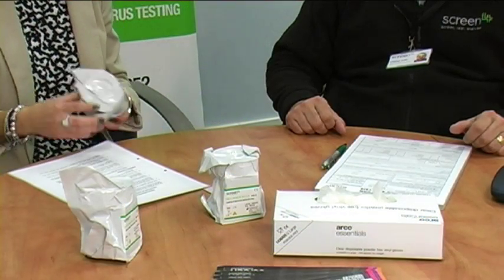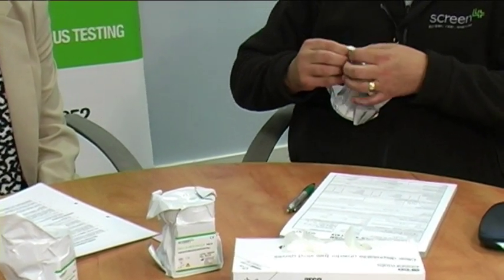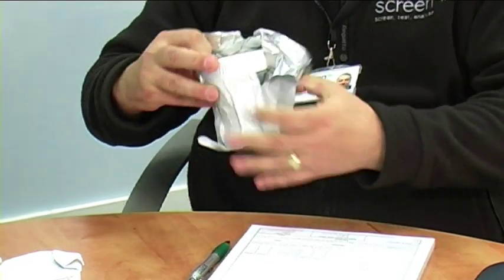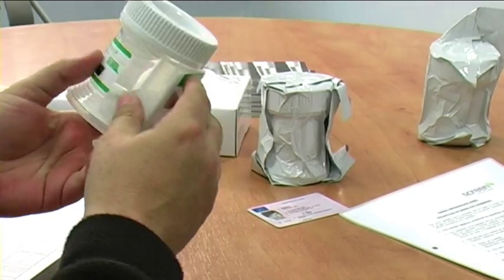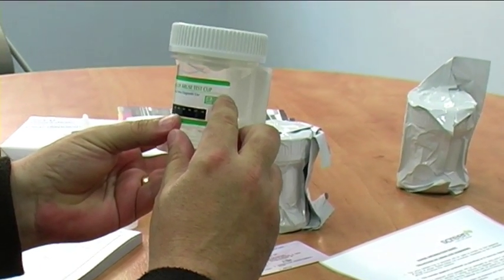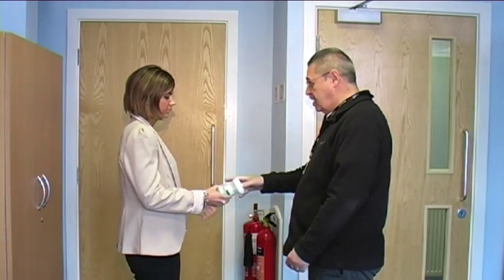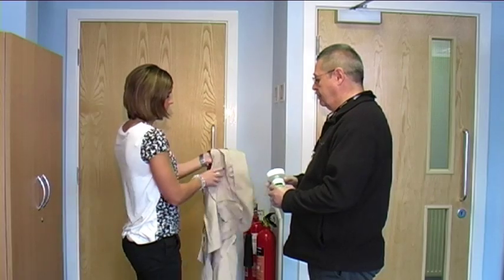Next, the donor will be asked to choose a drug testing kit from the selection provided. The collection technician will open the kit and remove the testing cup in your presence. The donor will then be asked to provide a urine sample of sufficient volume using the cup in full privacy for the testing purposes. Prior to entering the cubicle, the technician will ask that any bulky outerwear is removed.